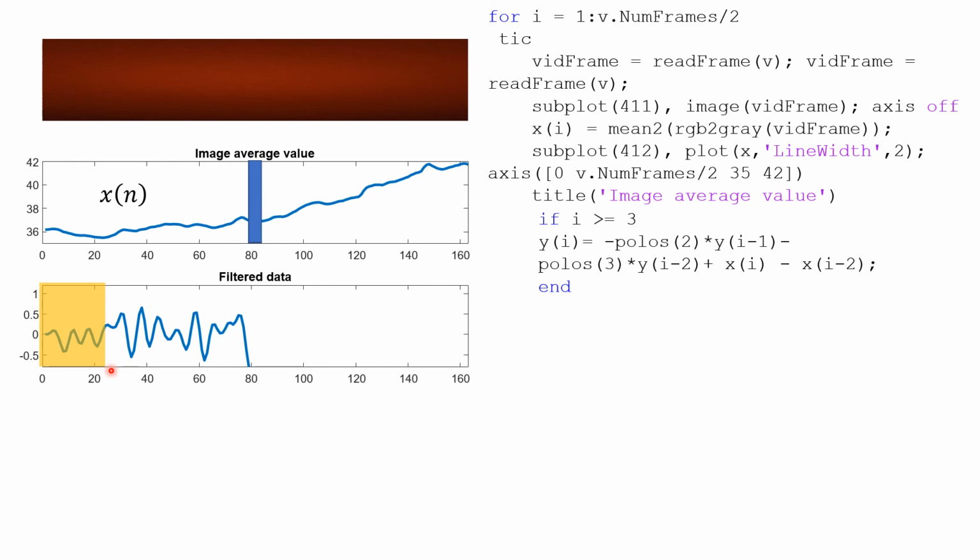After waiting for around 30 frames, I can compute the Fourier transform of that, check where the position of the peak is, so that I can estimate the beats per second. So I will decide that the length of the Fourier transform, and also the number of frames that I'm going to use for computing that oscillation calculation, is going to be 32.